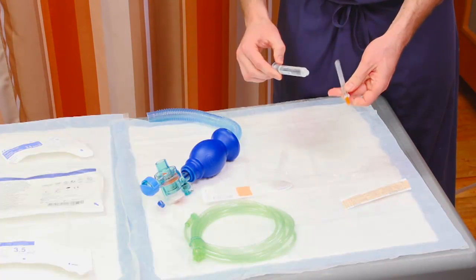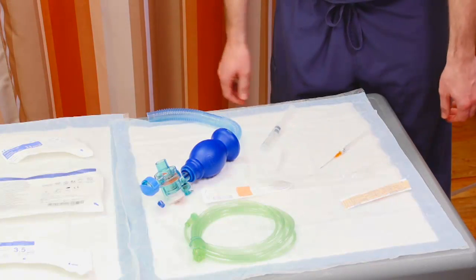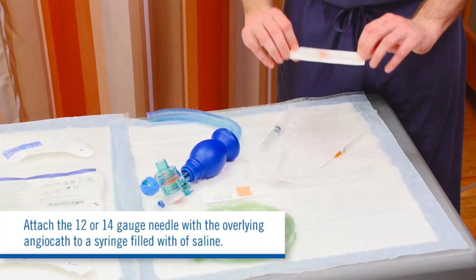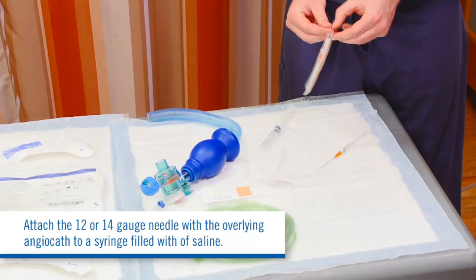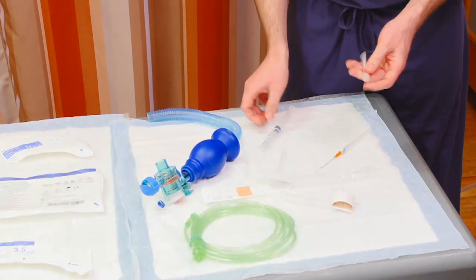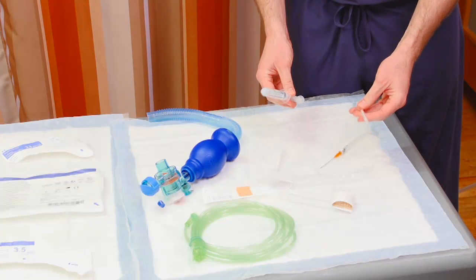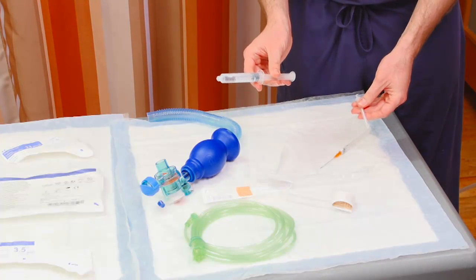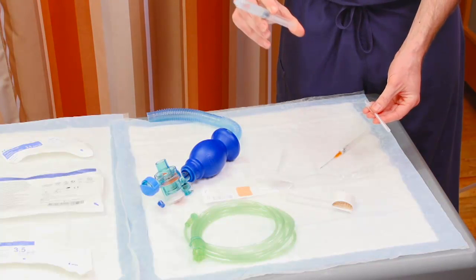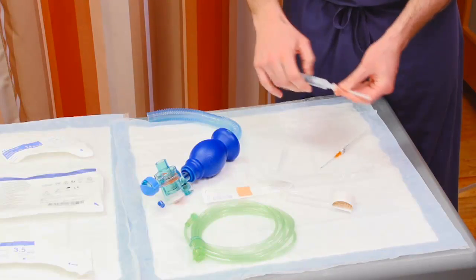Attach the 12 or 14 gauge needle with the overlying angiocath to a syringe filled with saline. Most texts endorse a 3 or 5 mL syringe, but for me, the quickest way to obtain a partially filled syringe is to take the pre-filled saline flush and squeeze out over half the volume. So that's what you need for placement.